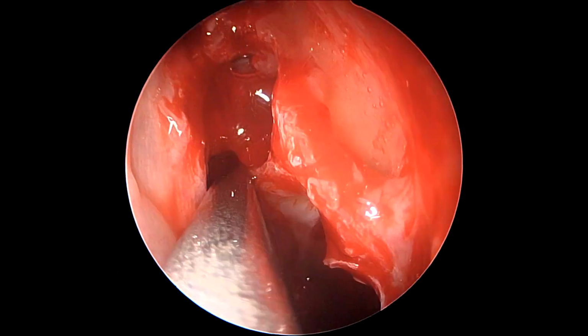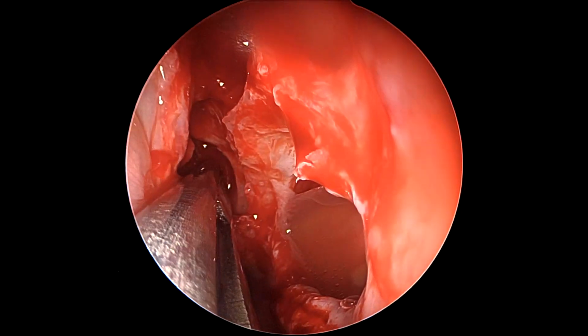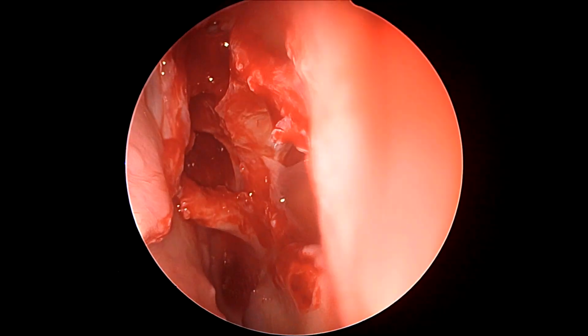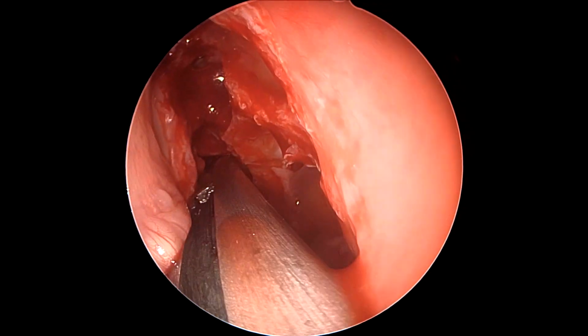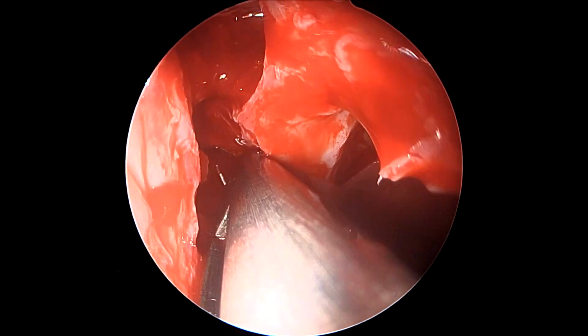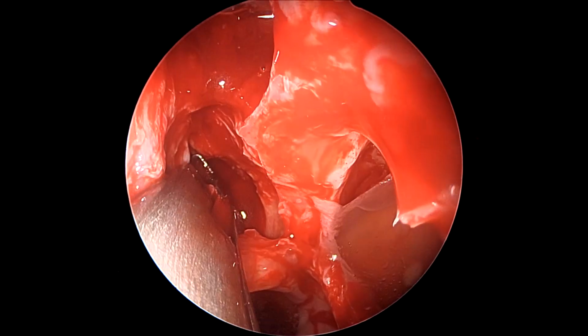Once we have located the sphenoid os, we enlarge it slightly inferiorly and inferolaterally, just like the right side, using a bone punch. Sometimes if the sphenoid wall is quite thin, one can even use a shaver blade. But normally these walls are thick and require a punch to conclusively bite the hard bone.